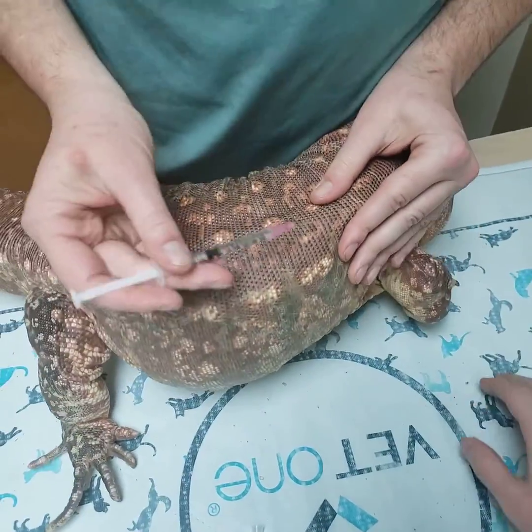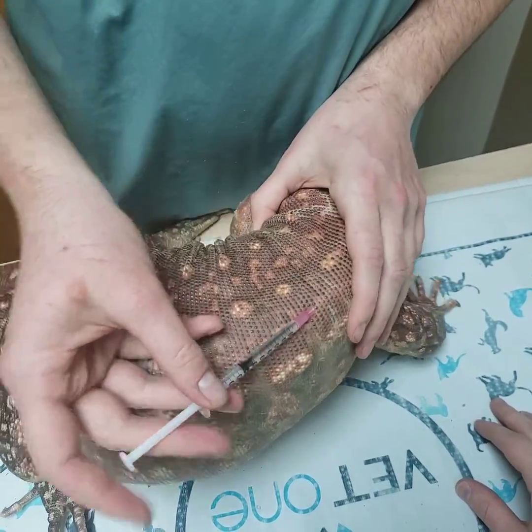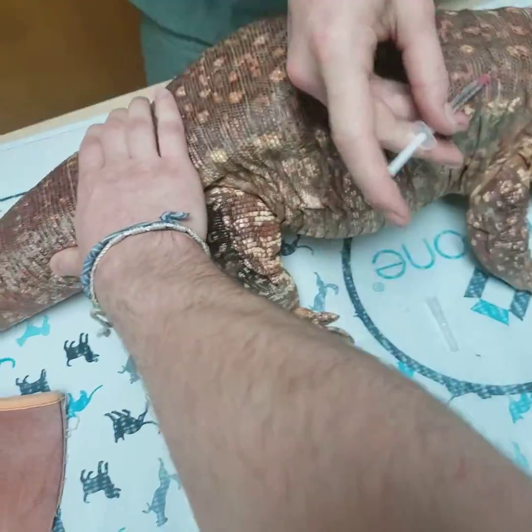Pinch up a little bit of skin. I will usually face the needle towards the head. Go underneath the skin. I draw back to make sure I'm not getting any air. And then we inject.